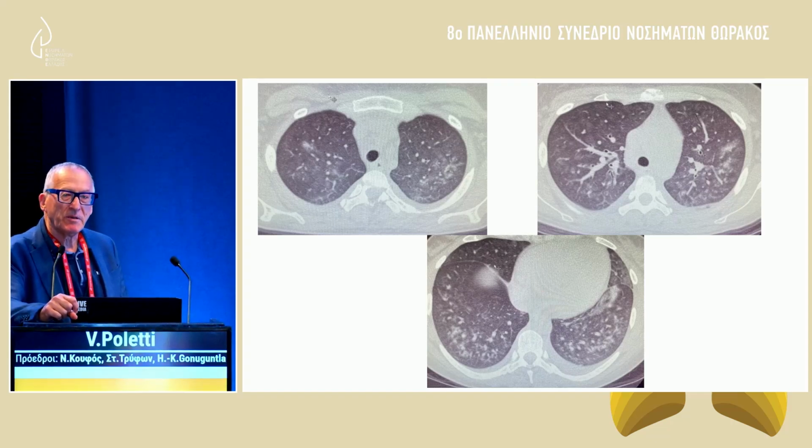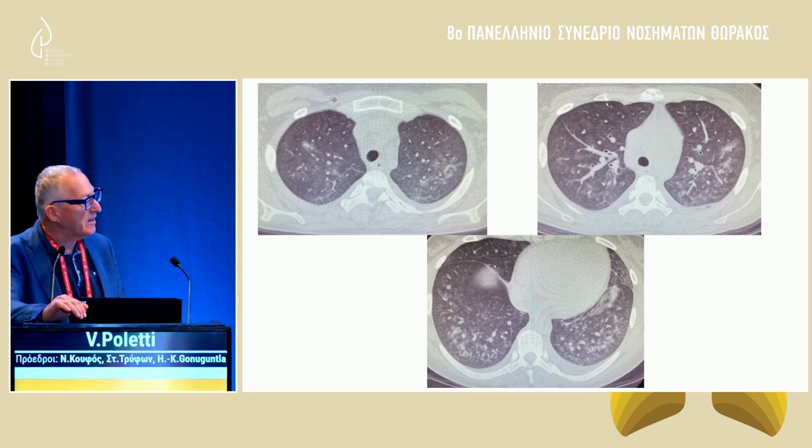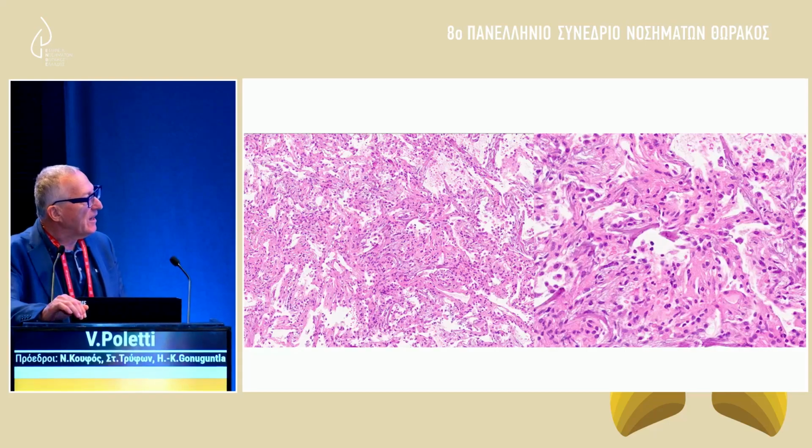It's not so typical for alveolar hemorrhage. It's quite strange. Considering the age and the CT scan aspect, our very good radiologist said he was not convinced it was an alveolar hemorrhage or ANCA-related vasculitis. The cryobiopsy showed diffuse alveolar damage with deposition of calcium in the hyaline membrane.